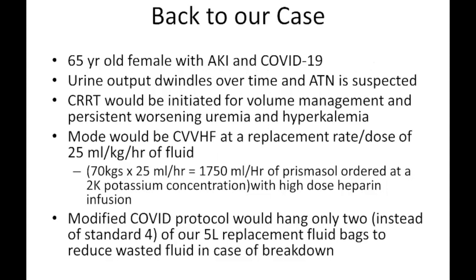And so in this scenario where a patient's hypoxia is worsening, number one, from their primary disease, but then secondly, from fluid overload administered, dialysis is reasonable, even if it's not for hyperkalemia or uremia. So CRRT would be chosen in this patient who's hemodynamically unstable. In this case, we would choose CVVHF as our default choice, and you would see a dose of 25 mLs per kg per hour of the fluid.